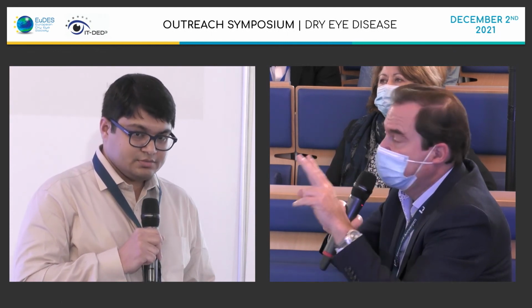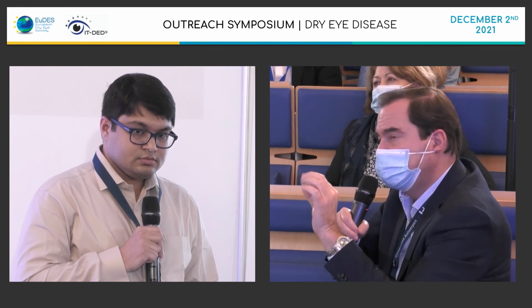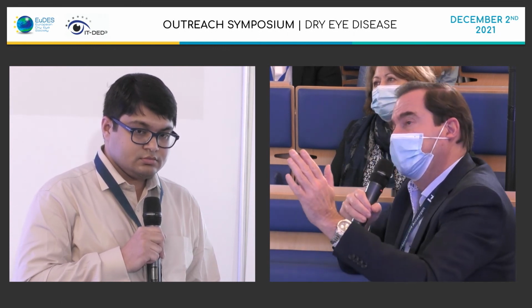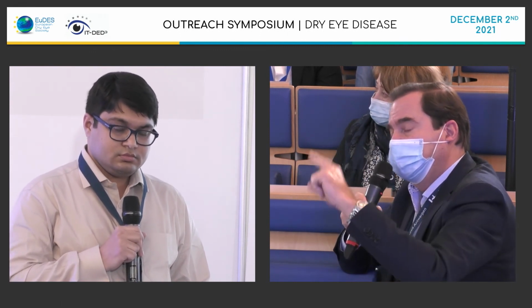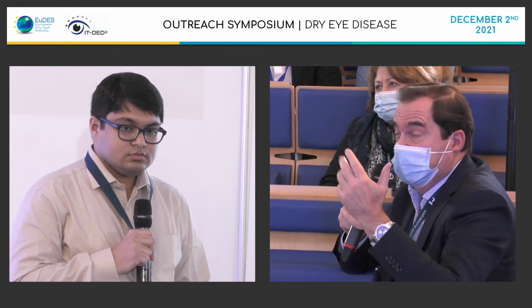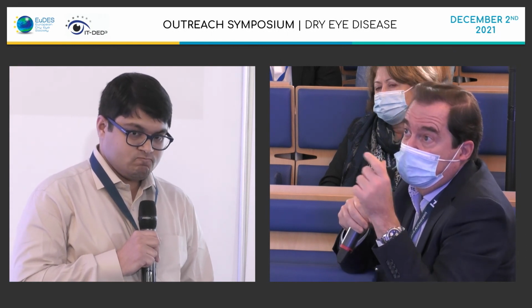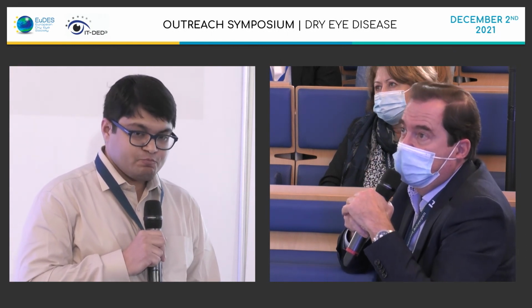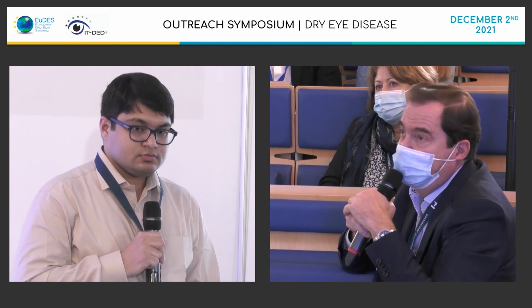By confocal microscopy, it's possible to differentiate lymphatics from blood vessels. The shape and the speed of the elements inside are different. Sometimes the inflammatory cells move to one side or the other. It's very interesting, and the future will probably be based on the flow to differentiate lymphatic vessels from blood vessels.